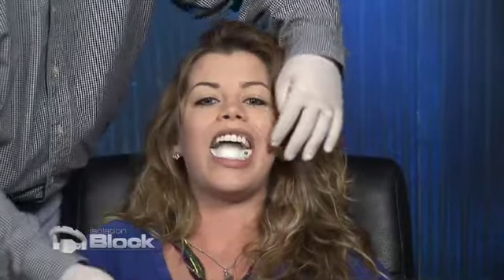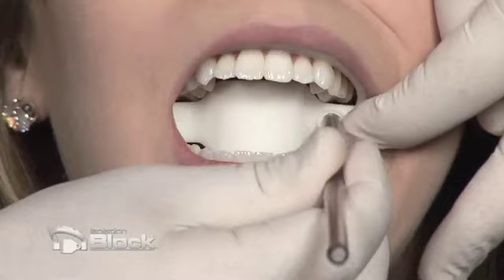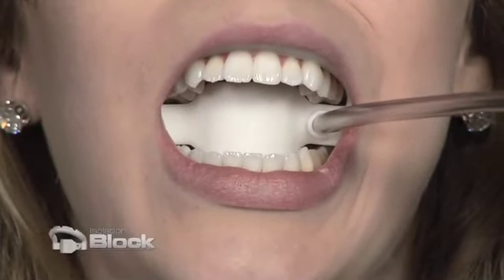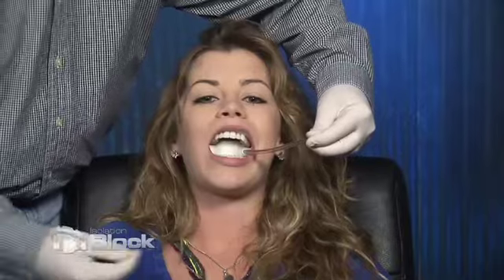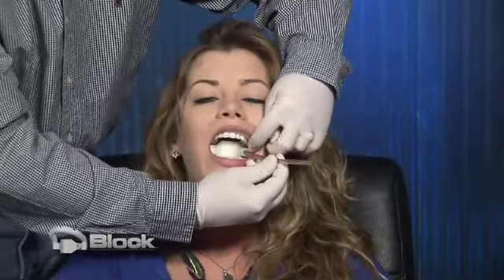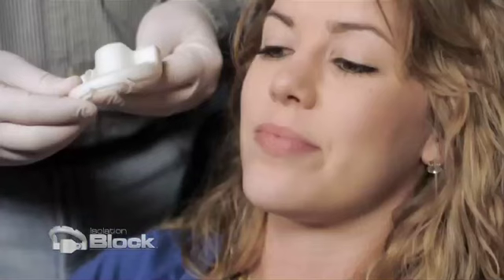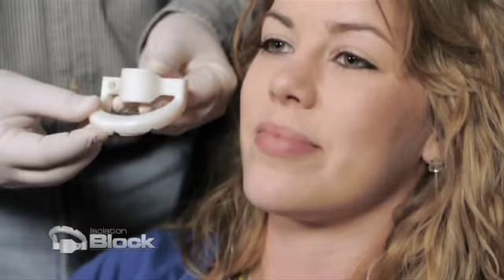Once it's in place, you take the saliva ejector, and it just plugs right into the front and hooks to the low volume evacuator. When you're ready to remove the isolation block, you just have the patient open slightly and it pulls right out. In placing the isolation block on the mandibular arch, you just turn the block over.